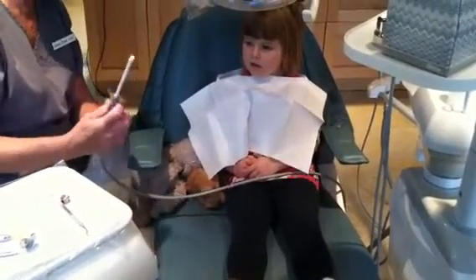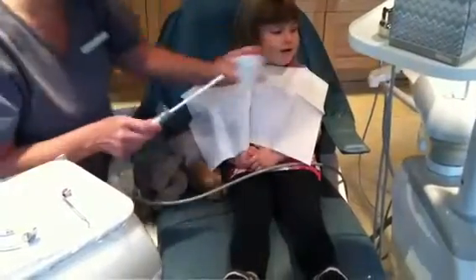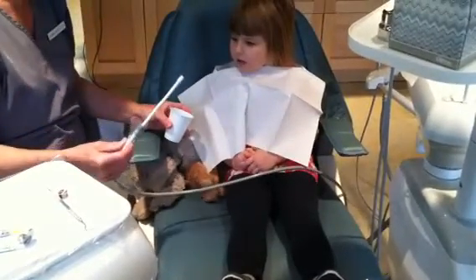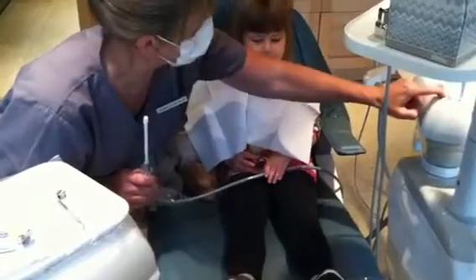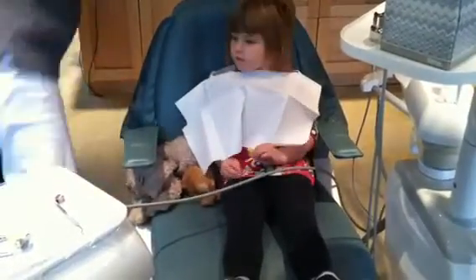So this — I'm going to turn this on. This is how you turn it on and it drinks water. Watch. And then you turn it off this way. I'm going to put this cup up again. So let's take a look at your teeth.